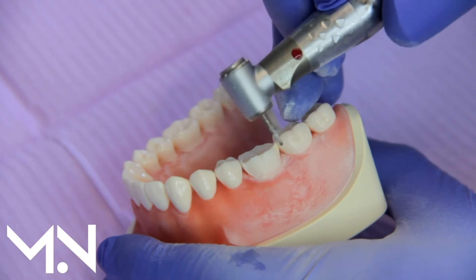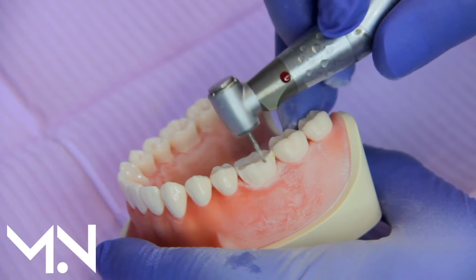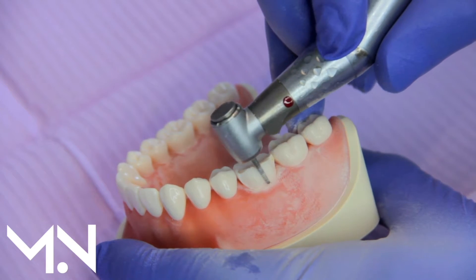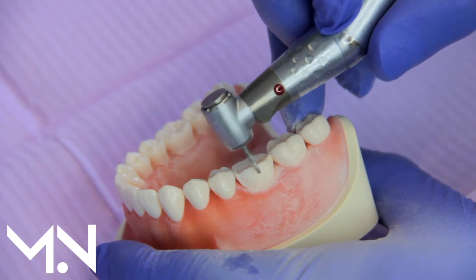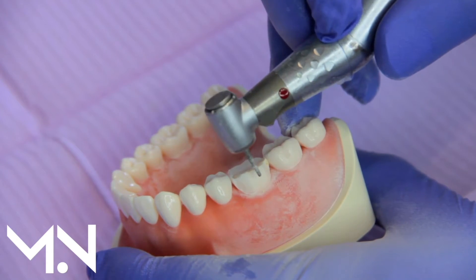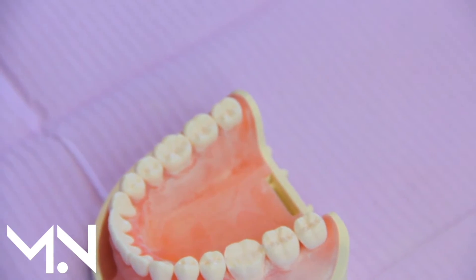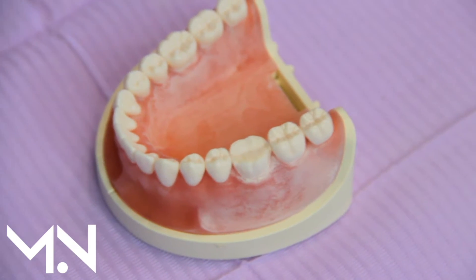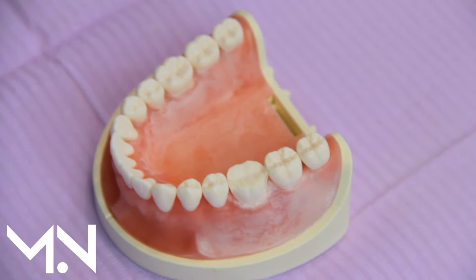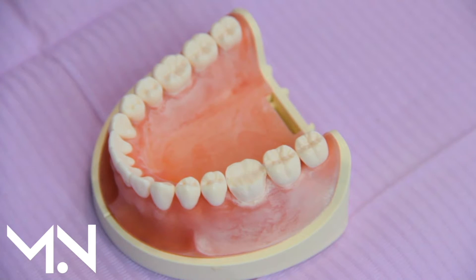We have some of the side completed here, and this is still pretty conservative for a crown. We've taken away a lot of the side — just shy of one millimeter on the margins — and we're right near the gum. We really want to avoid taking margins near the gum because it's always best to have your own tooth structure up against the gum.